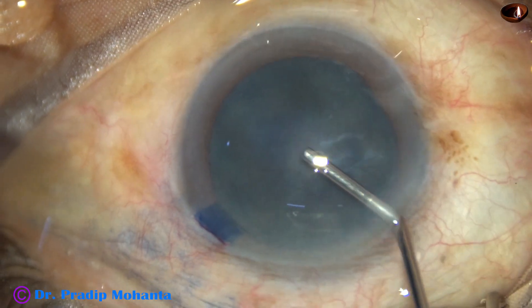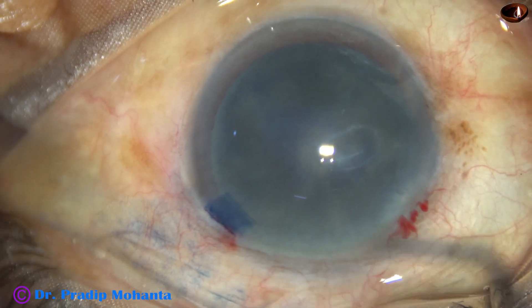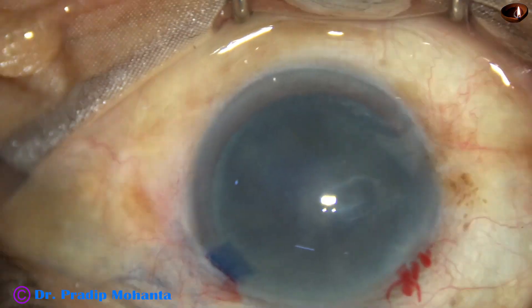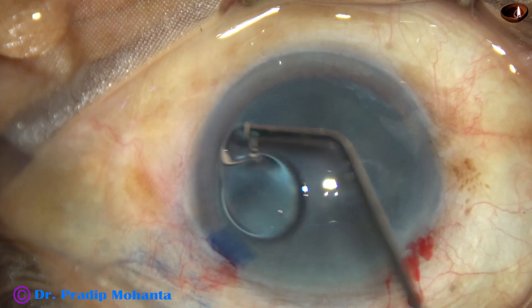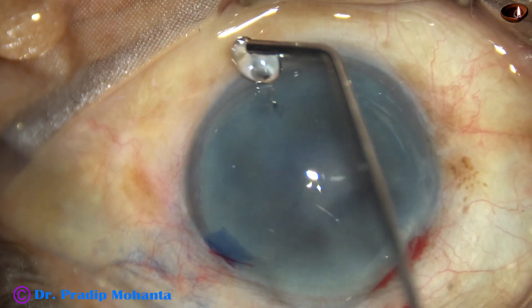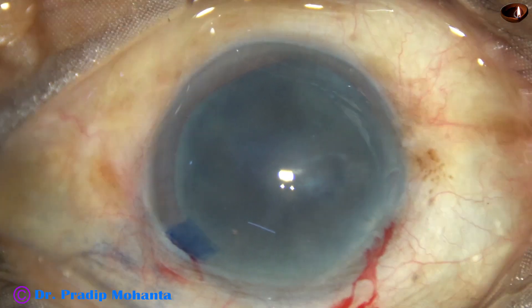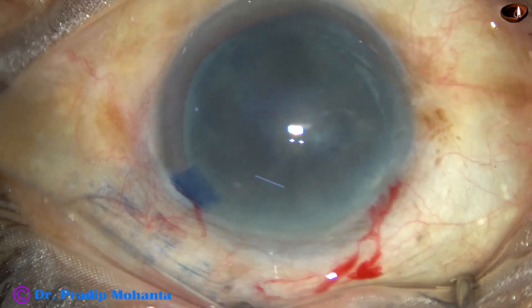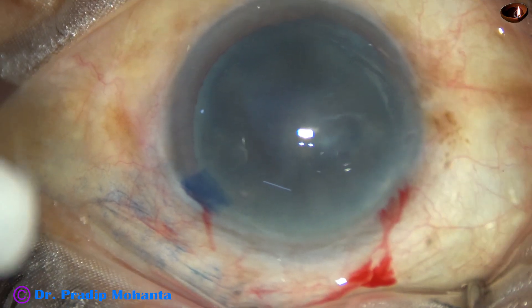2% hydroxypropyl methylcellulose (HPMC) is used to fill up the anterior chamber, and this HPMC is also applied over the corneal epithelium for better visibility. Now a Utrata forceps is used to perform capsular continuous curvilinear capsulorhexis (CCC).